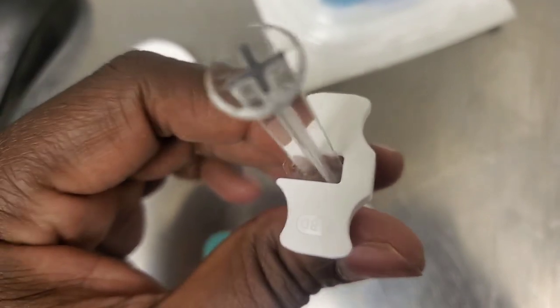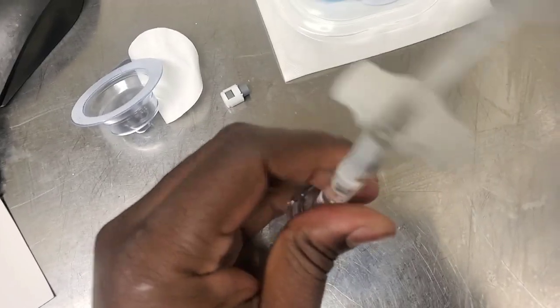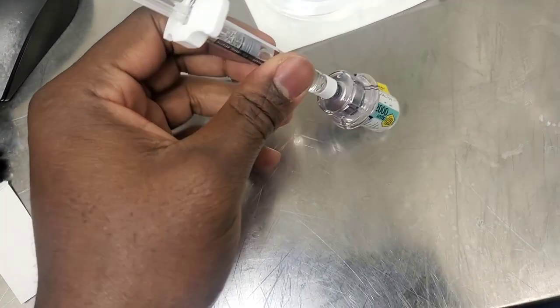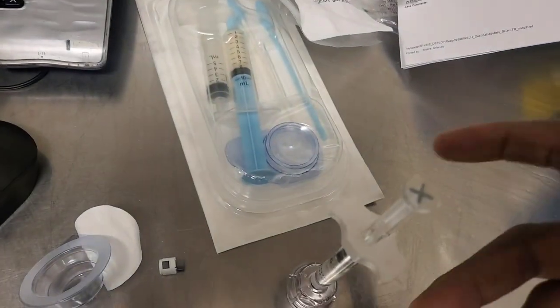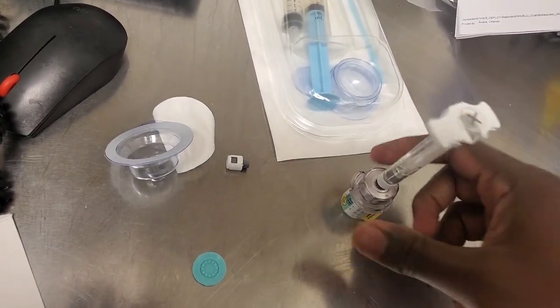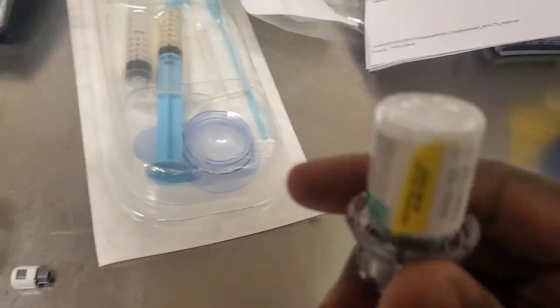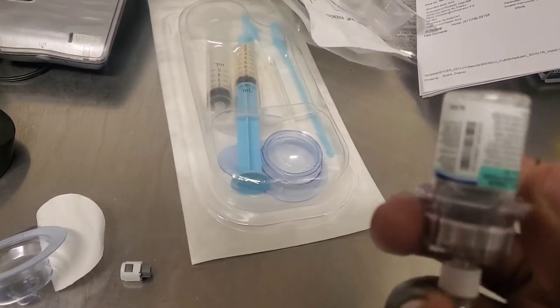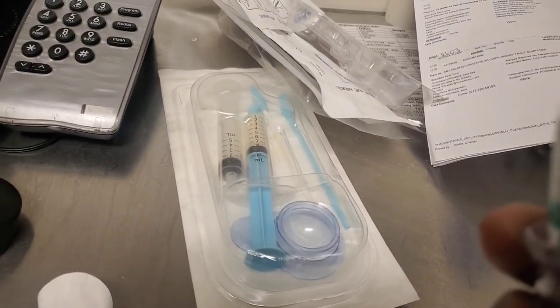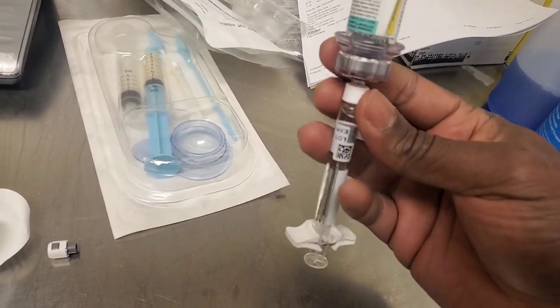Then I'm going to crack this piece and you want to insert it in, like that. And then you just want to squeeze down the liquid into the jaw. What I do is I shake it up, turn it over like so, and then pull the liquid back into the syringe.